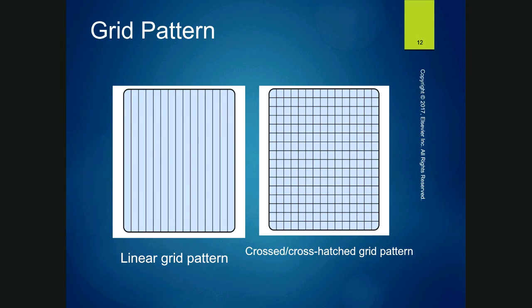But when you're doing portable exams, you don't want to have something that you have to be exactly perfect with, because you can't be. Portables are done under less than perfect circumstances, right? So linear grids are more often what we are using in our applications in X-ray when you go do a portable.